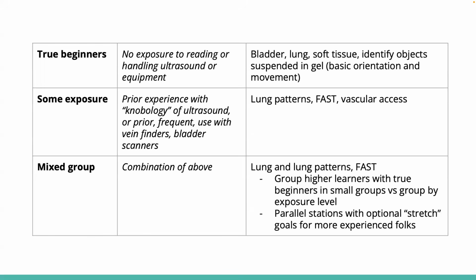And then with a mixed group, a combo of the above, but also thinking about how you want to set up your groups. You can do it a couple of different ways, and there are pros to each. So thinking about what the makeup of your groups might be, or what your learners might be.